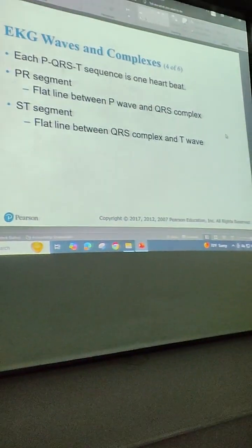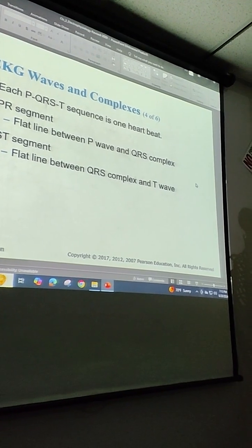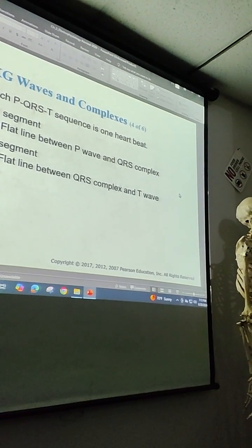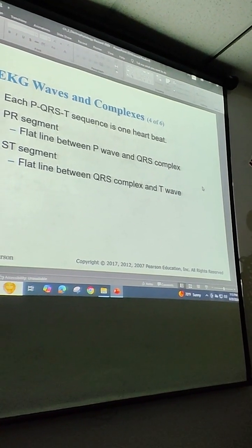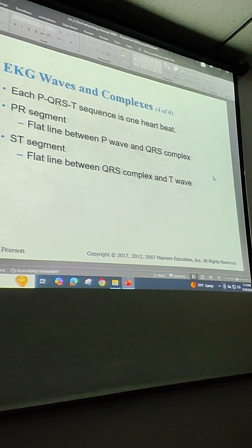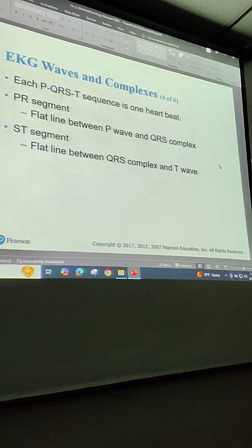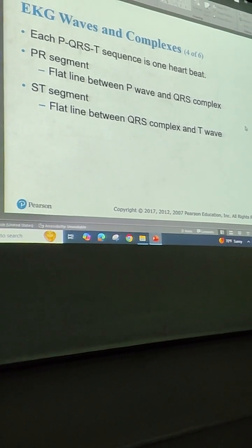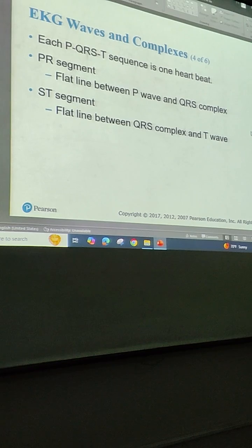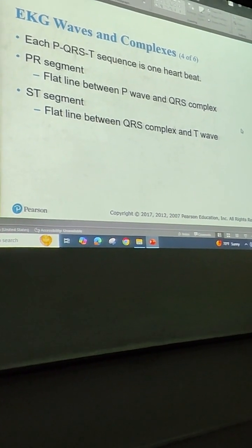The first day, remember, flat line means a pause. So that's the isoelectric line, that's the baseline. The flat line, but you can measure the time, the space in between this and that. So just for you to get it. Because sometimes when we learn only one definition and we encounter something else in the test, we don't see what we thought was the only possible answer, so then we cannot build on it. So that's it.